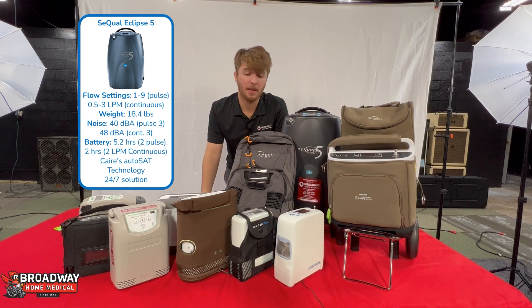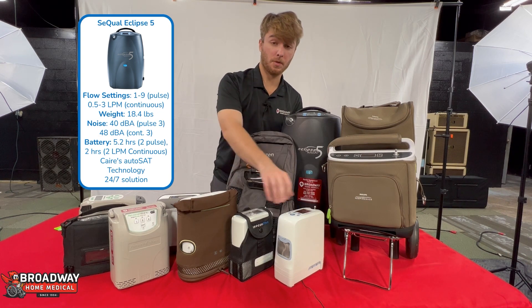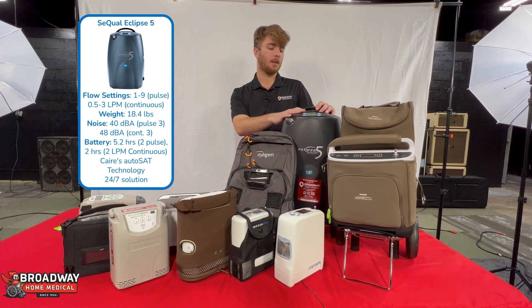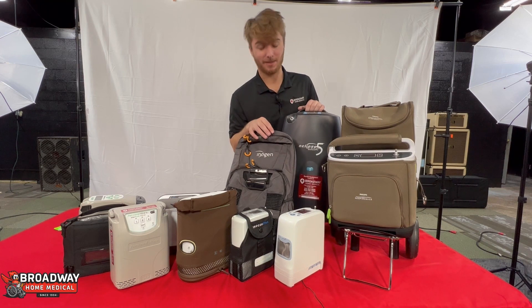On top of that, it has a really long battery life. If you put it on the highest setting, it does get pretty loud. But if you have it on a lower setting — like a setting that these normal machines would do — it's actually really quiet because it's so big. This machine is also capable of 24/7 use if you need it to be, which actually makes sense with this one because it's huge.